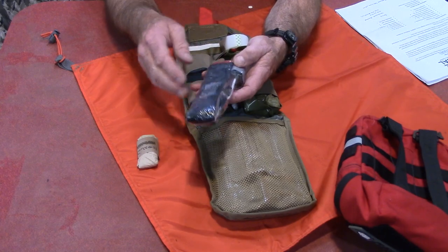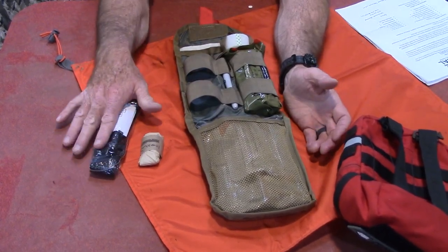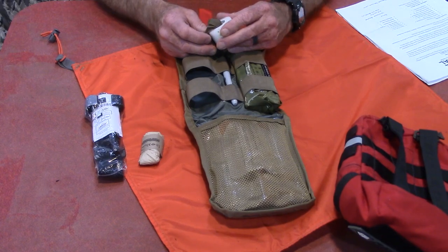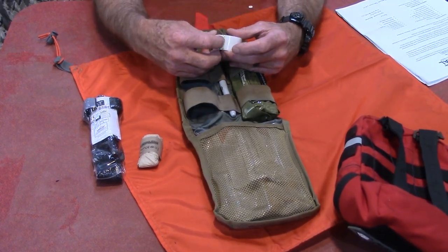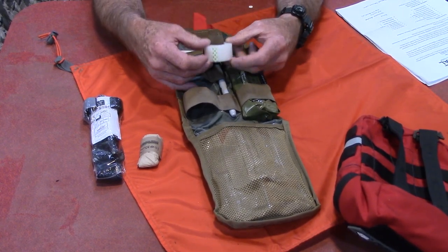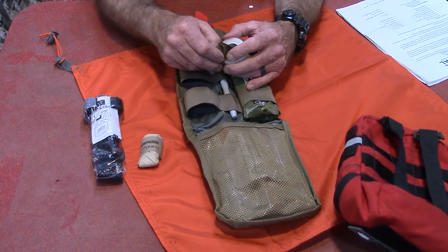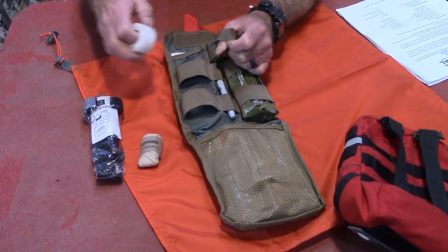We have a roll of medical tape — this is a really strong medical tape, not some cheap flimsy garbage. It's one inch by 10 yards, 30 feet of tape, and it has its own little Velcro closure. Moving along, there is an actual Sharpie that you can write on the tape, write on the tourniquet — your time on it — anything you need to write, any kind of triage info. You can even write on somebody's skin. That's a good thing to have in a trauma kit.